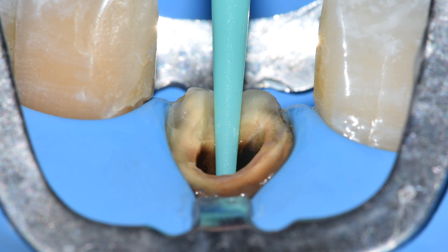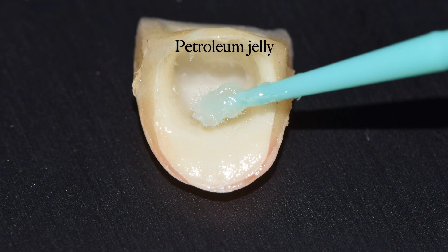We need some kind of separating medium so that the core does not get adhered to the prosthetic crown. As I mentioned, petroleum jelly is the best separating medium for this purpose. This is the coating of Vaseline or petroleum jelly on the intaglio surface of the crown — I have applied petroleum jelly all over the internal surface. One thing to note is that it should not be too much in excess; it should only be a thin coat applied circumferentially all over the surface. Once this step is completed, I am injecting my core material inside the root canal and luting the post. I am also injecting some amount of core material inside this prosthetic crown, and once this is done, I am seating the crown in place.